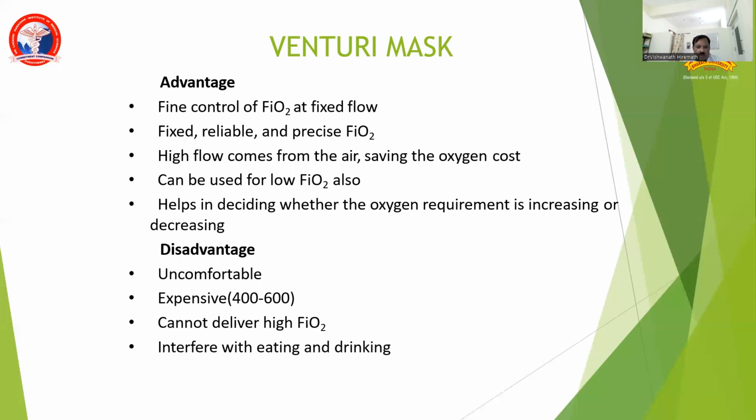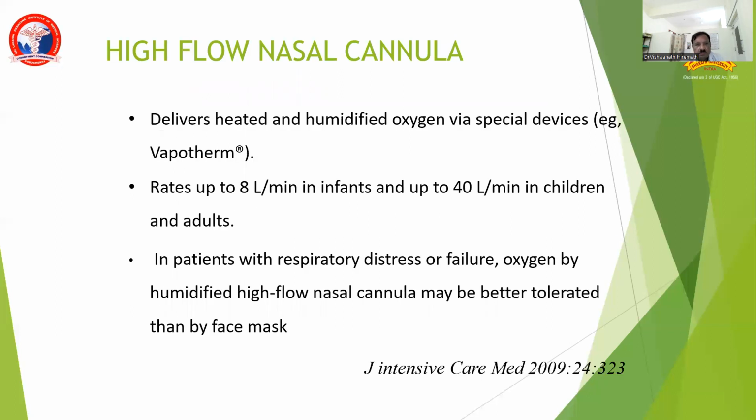Disadvantages: uncomfortable, expensive, cannot deliver very high FiO2, only 24 to 60%. They interfere with the patient's activity, eating and drinking.